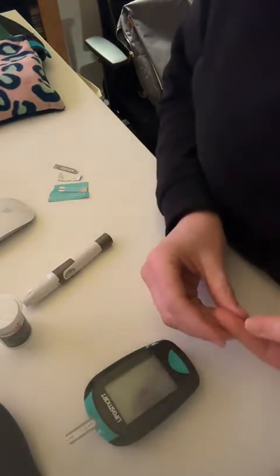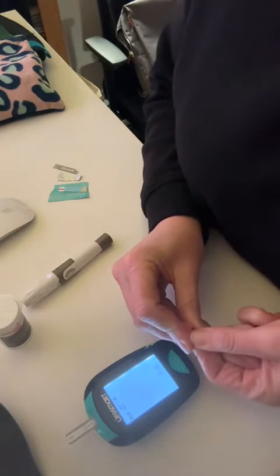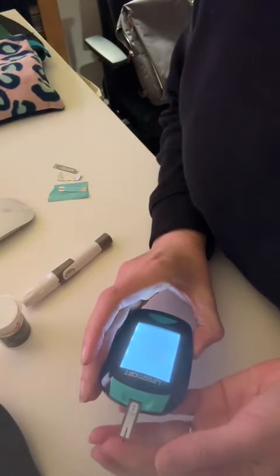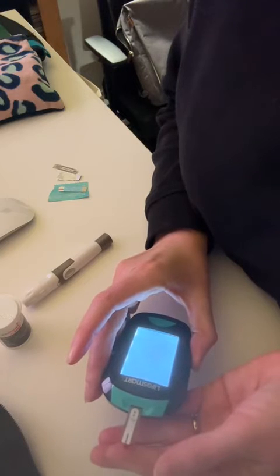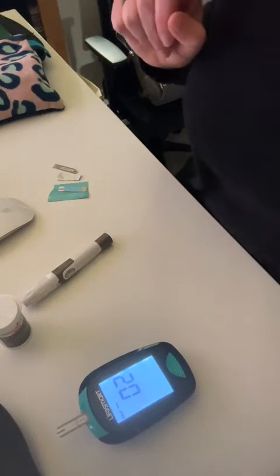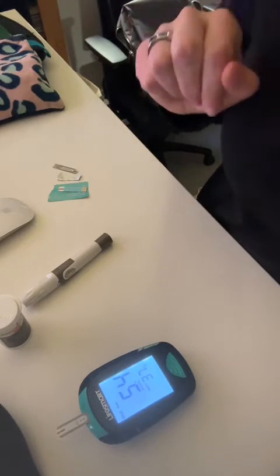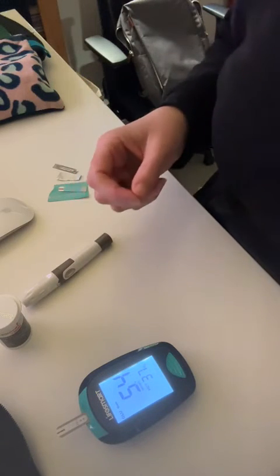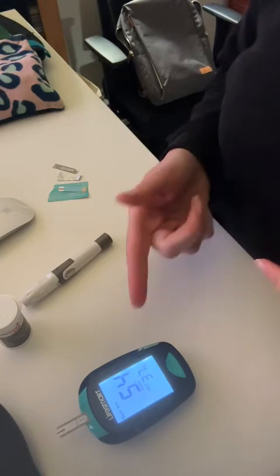Sometimes I have to re-prick my finger which is very annoying. Let's see if it comes out — oh, still there, that's fine. I did have a coffee this morning with cream, so my glucose is still pretty high from that. I like to keep my glucose under five.